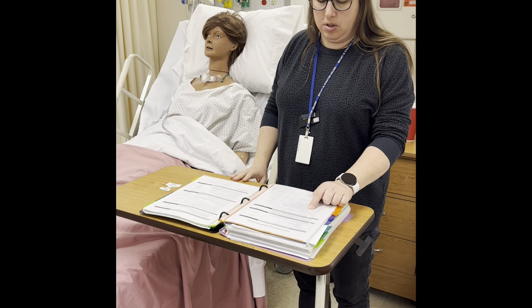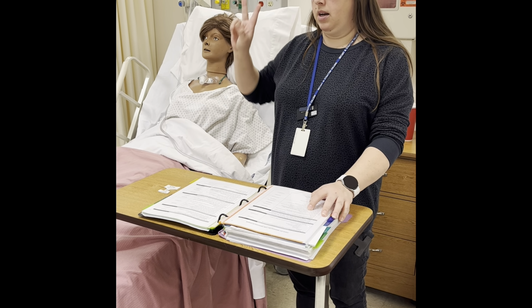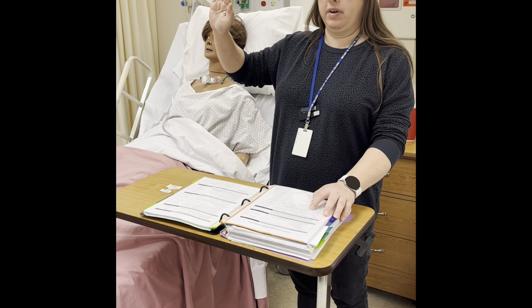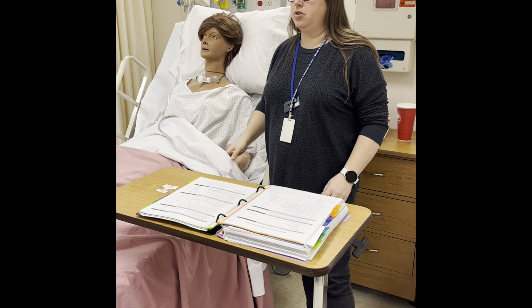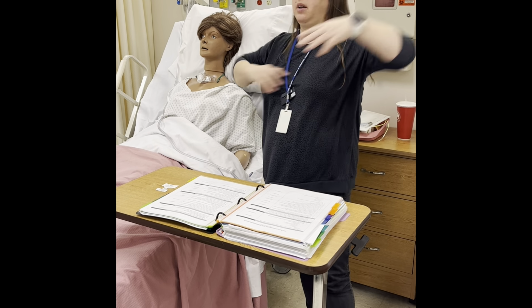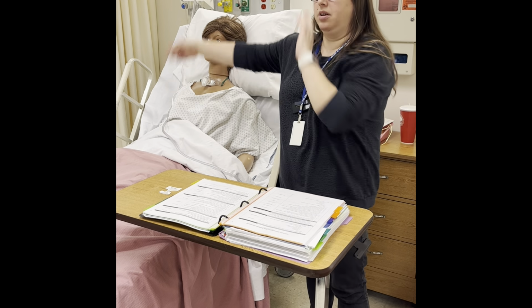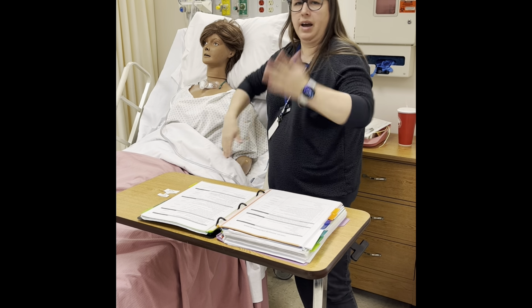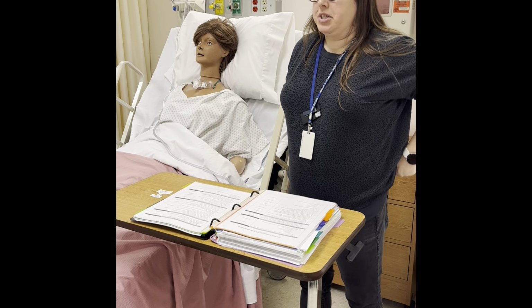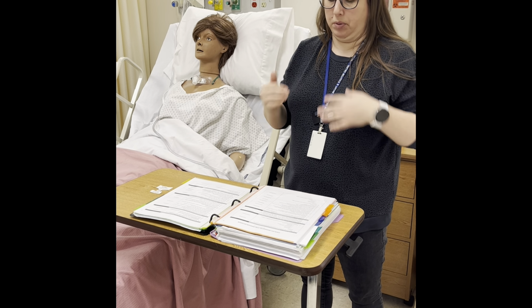The next step tells you to develop a hand signal for the client if they're in distress. So a peace sign, like one finger, or all 5 fingers together like a stop sign. Because if our patient in real life is in distress, they're doing a lot of this when you're trying to put it in because they don't want it in. Once you start to put it in, they don't want it. So does this mean that I can't breathe, or does this mean you don't like it? I don't know what that means. So we need to make a conscious effort to have a hand signal that they can tell us, I feel like I can't breathe. That's really what that's for.